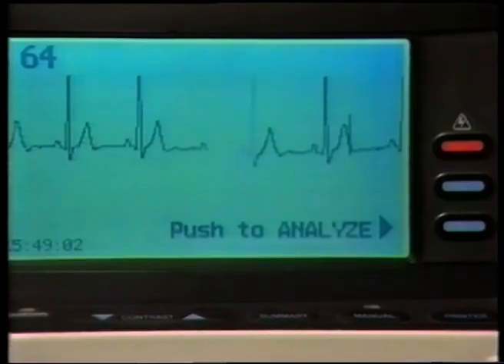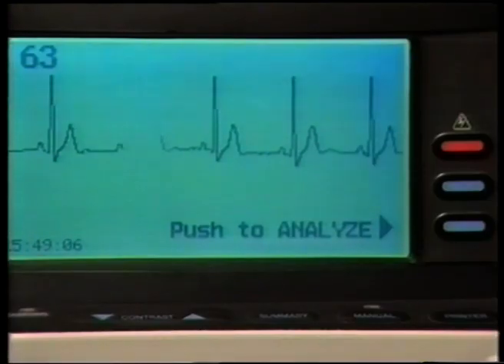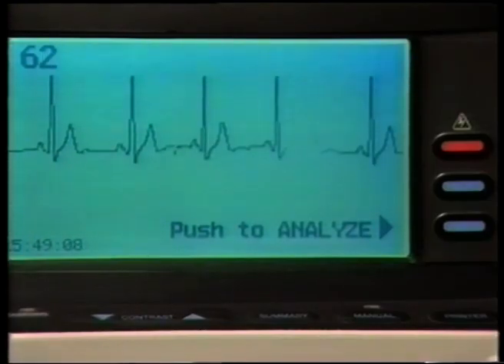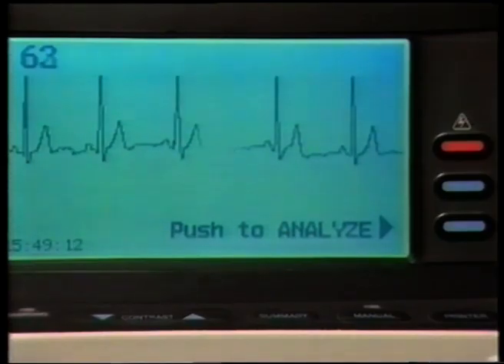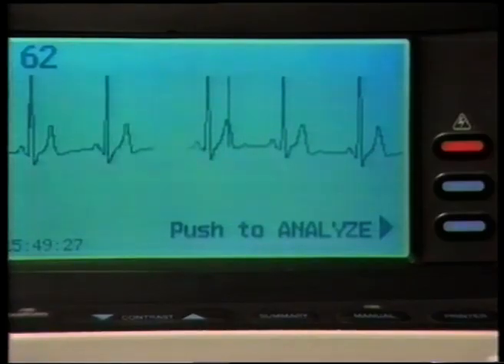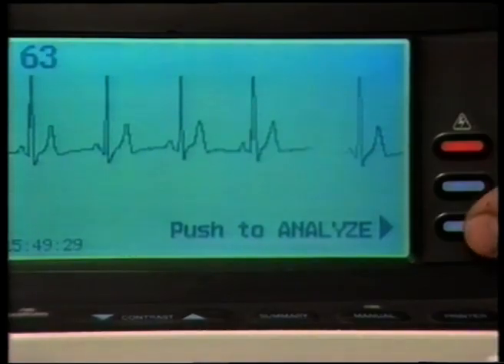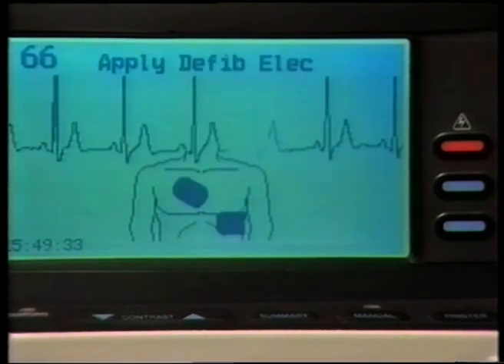As a safety feature, the LIFEPAK 300 will not analyze or defibrillate through conventional ECG electrodes. If analysis or defibrillation is needed, you will need to connect the defibrillation cable and apply the disposable defibrillation electrodes. If the push to analyze button is pushed with ECG electrodes connected, the LIFEPAK 300 will remind you to attach the defibrillation cable.